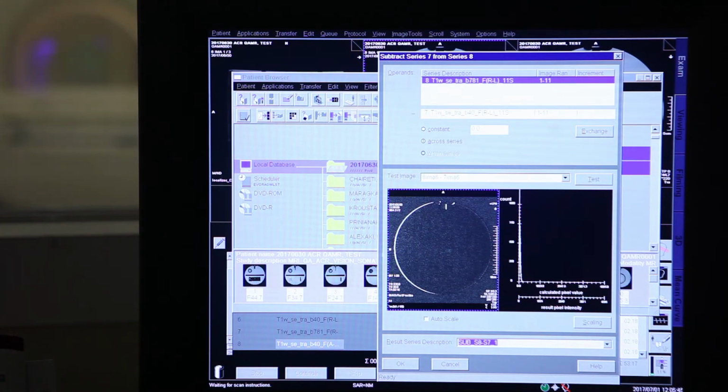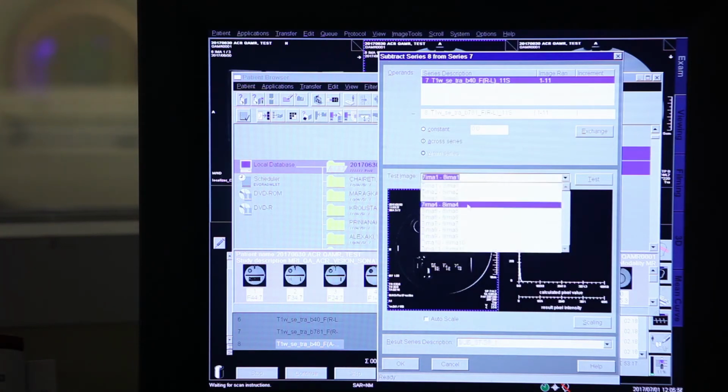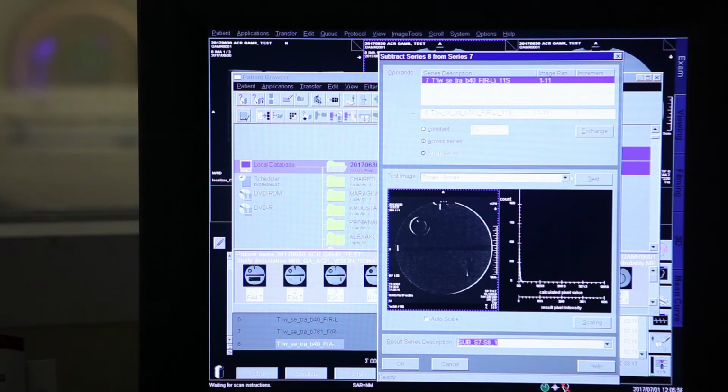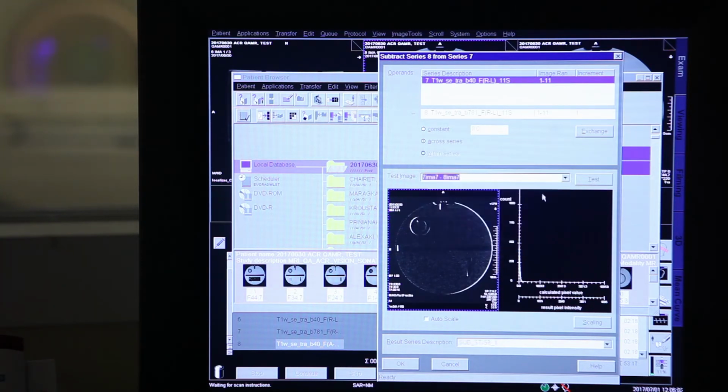Important also to mention, if you exchange the sequences and do a test, this is going to go the other way around. It's an algorithmic trick, but you can do it. Also important, you can go in number 4 and test it, or you can go in number 6 or 7, I don't remember.